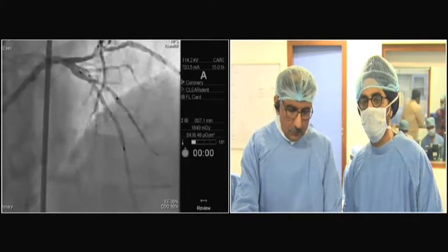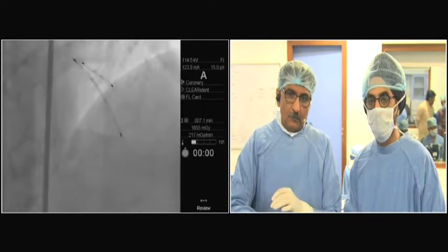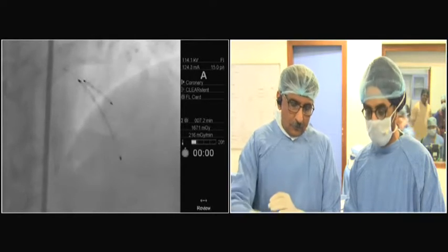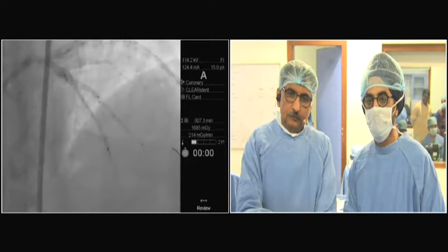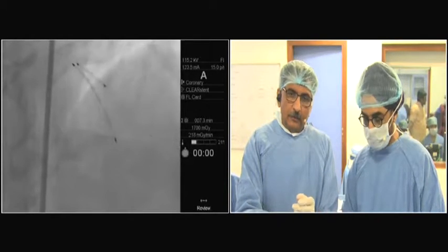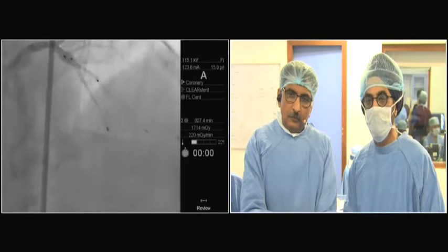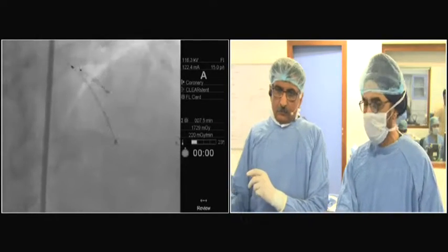I'm never doing double stenting beginning with the side branch. And when I have to do a double stenting, I know from the beginning that we'll have to implant a stent in the side branch after the main branch. And a POT is, in this technique, absolutely essential because it opens completely the door toward the side branch. So if you do provisional, the POT is absolutely necessary for double stenting technique.